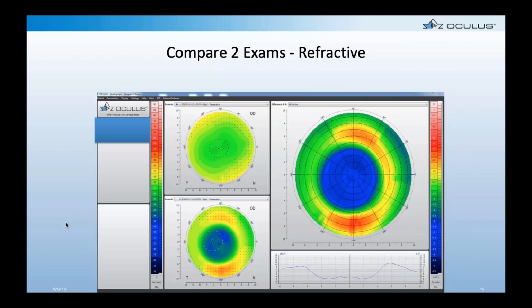And my first stop is to the corneal topographer, so I can look at the patient's maps, because that's the all-important part of success with Ortho-K. More than looking at a lens on the eye, it's what does the topography look like after treatment. And based upon my comparative refractive map, I can see how much refractive error I've actually corrected.